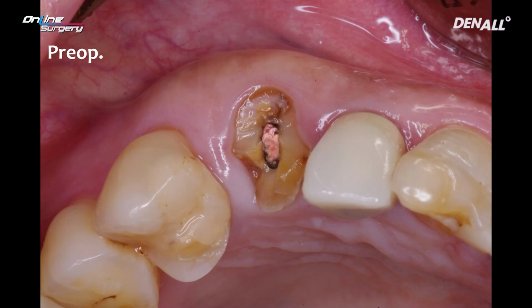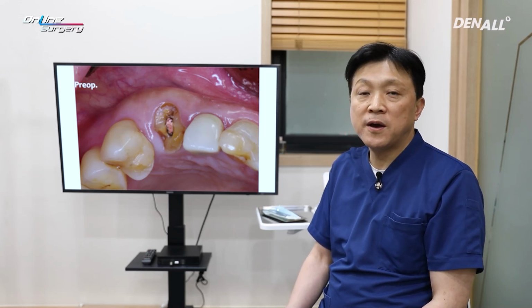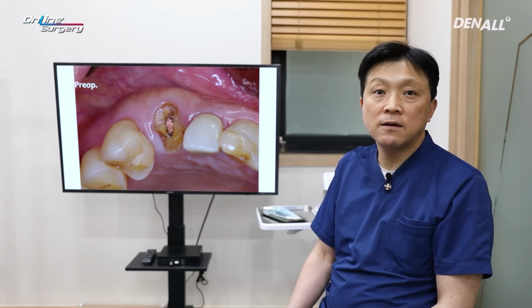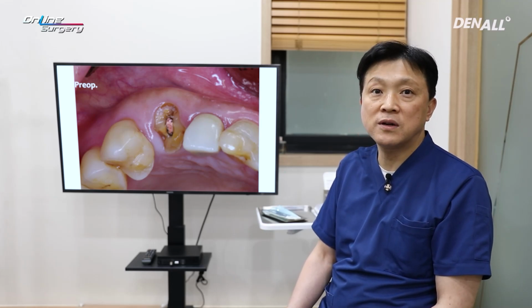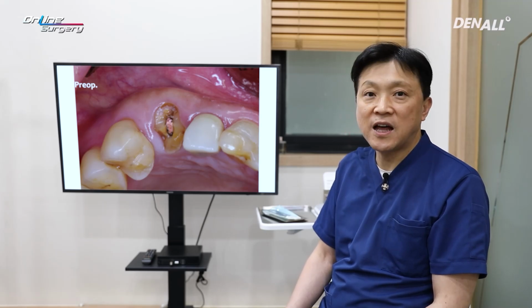You can see that there's highly contoured labial bone. The thing to note here is that we should not assume that the labial bone will be fully contoured to the apical portion. There can be very steep angle.